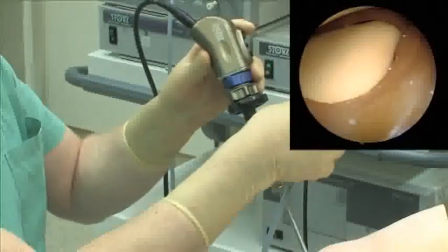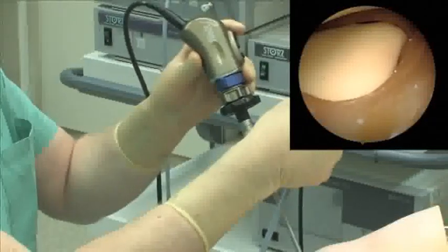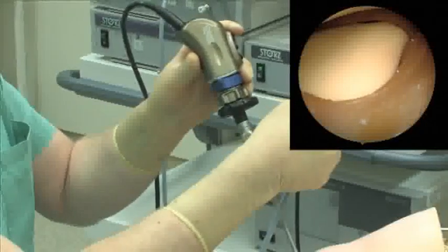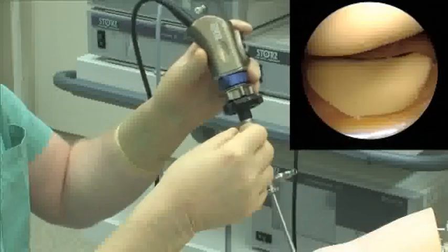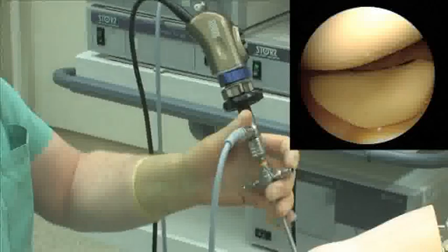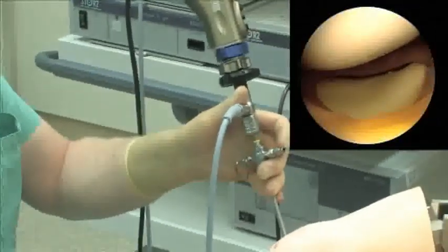If we position the light cable at 12 o'clock, we look directly at the posterior horn of the lateral meniscus. Here the field of view is also limited. The major part of the lateral meniscus is not identifiable. Only when the light cable is moved to the 3 o'clock position is a good field of view over the whole lateral meniscus and lateral compartment possible.